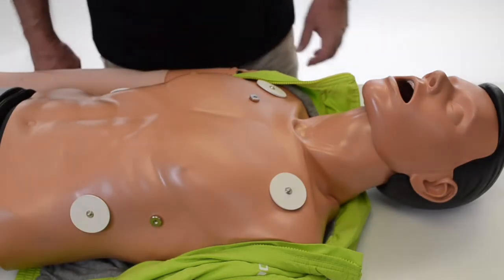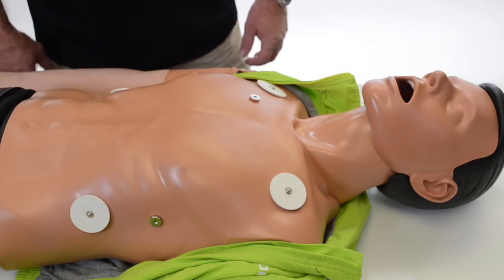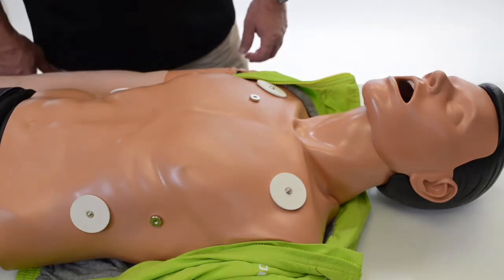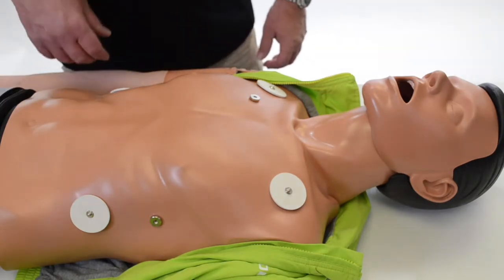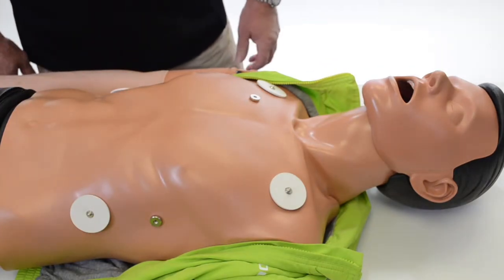We're going to talk about defibrillation and being able to defibrillate and use an AED for training. The two mannequins that we can do that with are the Ambu Man Advanced and the Ambu Man Defib.